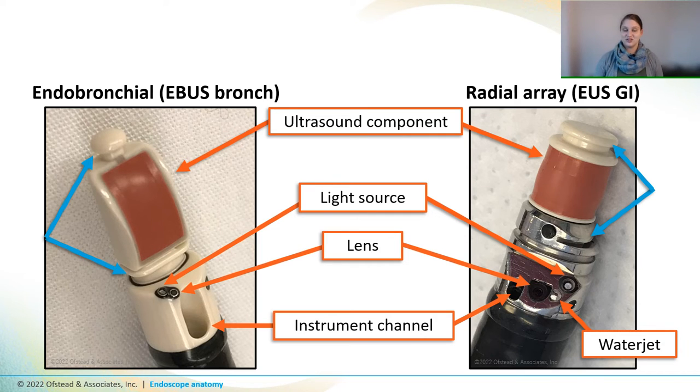If you're paying close attention, you might have noticed that both of these scopes have grooves along the edge of the ultrasound component. During procedures, a tiny little balloon is actually placed over the ultrasound and filled with water to help conduct ultrasound waves from the scope to the patient tissue. And as you might imagine, it can be really tough to get all of these grooves and tiny little channel outlets clean. And one goal of visual inspection is to make sure that all the blood and soil has been removed before sending the scope for disinfection or sterilization.